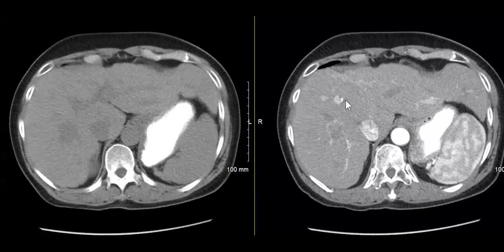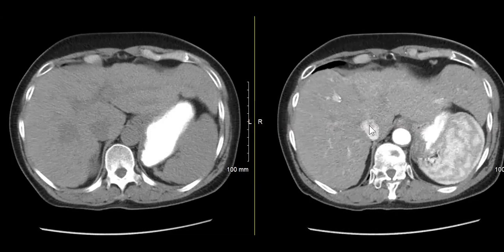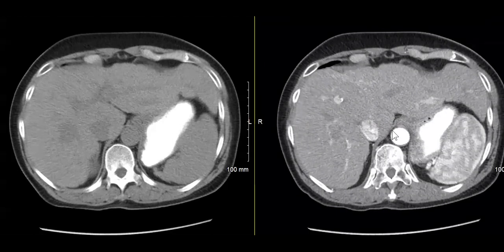So in this case, this is pre-LIRADS, but they thought it was some sort of atypical lesion, so this was biopsied. And original biopsy came back as poorly differentiated carcinoma with CK19 positivity, which is again similar to what I showed you before. When I got the path, I looked back and thought, oh cool, another CK19 positive HCC. Then this patient had a complete resection, and with the full immunohistochemical profile, this ended up being intrahepatic cholangio.